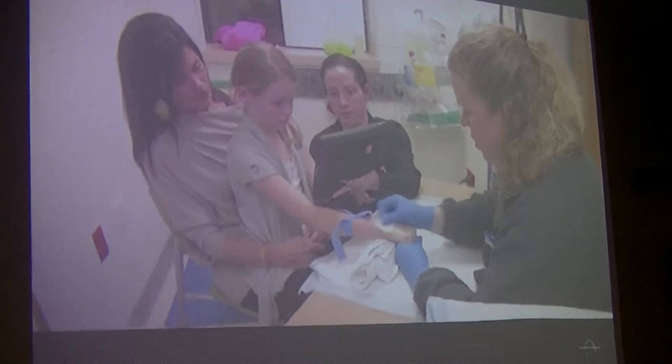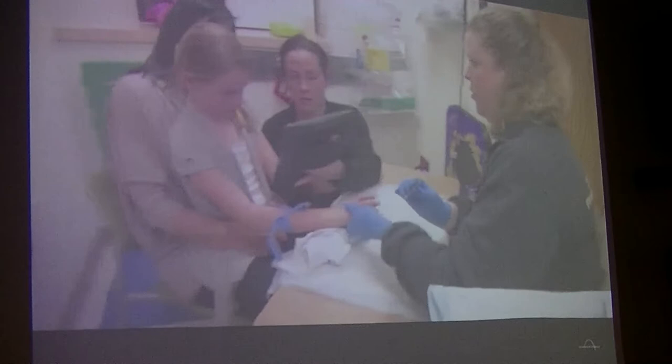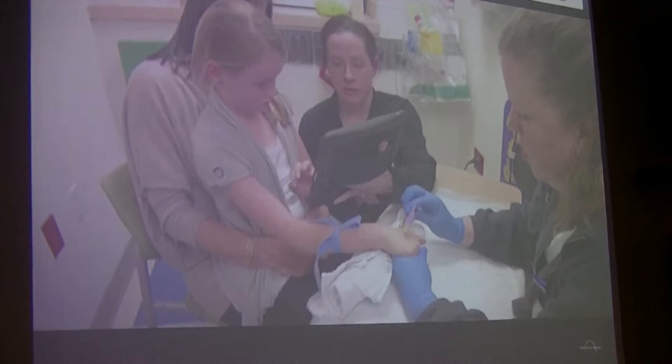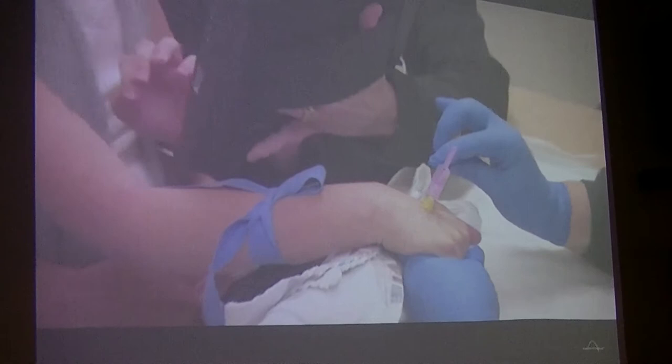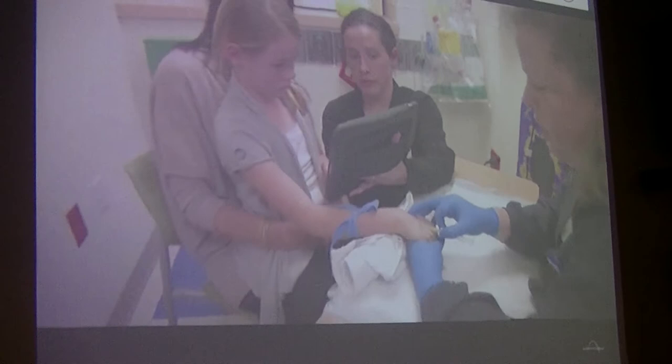There's two types of kids. Some are watchers, and no matter how much distraction you do, they're still going to watch, and they do better. And some kids don't want to watch at all, and that's when the iPads and the games and the toys come in handy. One, two, three, big stick. One, two, three. Good job. All right, so you get to choose. Ready? Press on three. One, two, three.